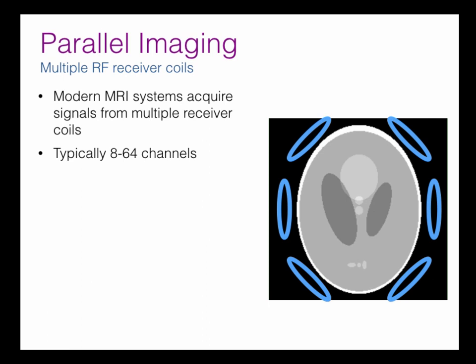So all the signals were coming through and would come out on one cable, and it's all just one composite element, if you like, to pick up the signal. In a modern scanner, we typically have 32 or 64 channels. Sometimes fewer, but that's a pretty normal number now to have 32 channel or 64 channel array coils. I'm showing just 6 here.